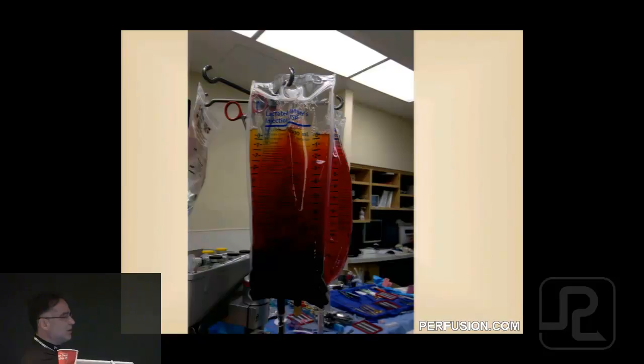This is 3.5 hours sitting. We don't agitate the bag at all during the case. Of course, this is the blood-tinged bag of LR. Red cells, clotting factors up here. Now, if we need volume, if we need red cells during the case, we will drop it in, but we'll not drop this in until the end, or we'll clamp it and hand it to anesthesia.